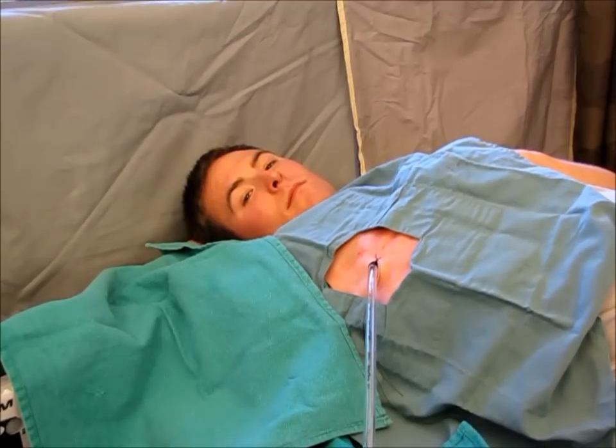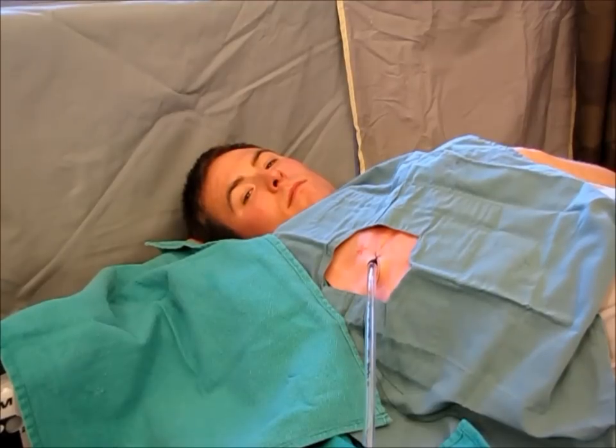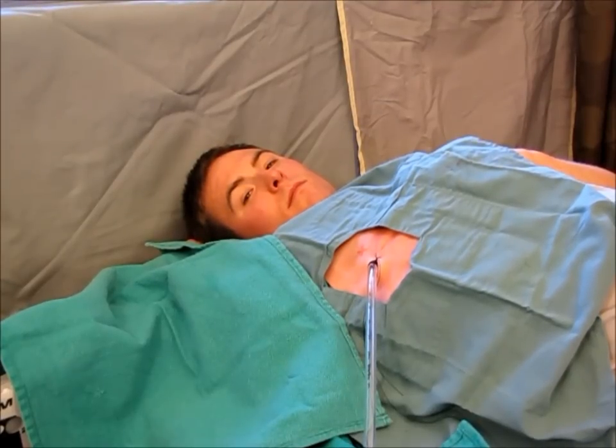Now that you have your occlusive dressing and the chest tube is ready for removal, the goal when removing a chest tube is to create a positive pressure inside the thoracic cavity. This positive pressure will aid in forcing any residual air out of the thorax, thereby preventing a pneumothorax. To effectively do so, you must practice the process of pulling out a chest tube with the patient multiple times.